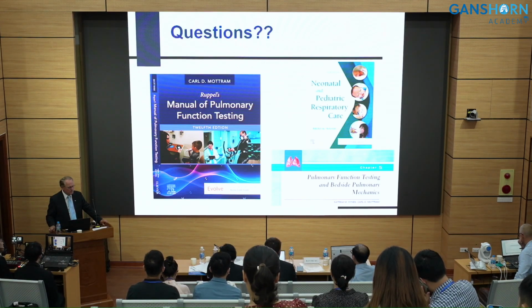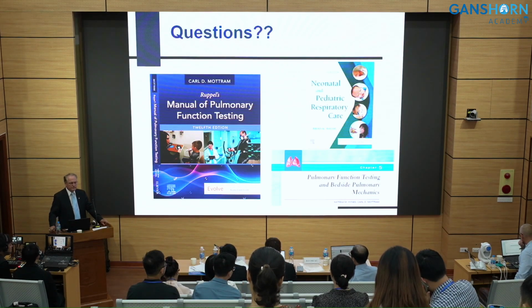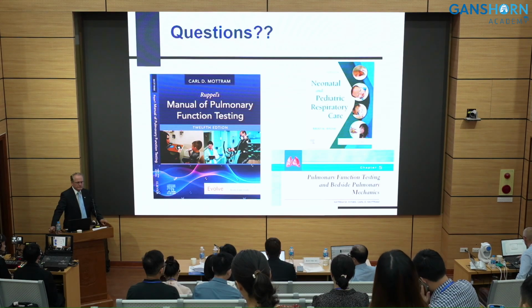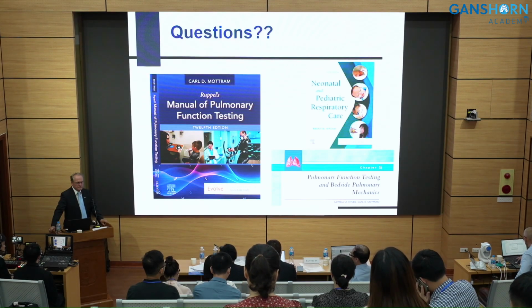Đối với trẻ em, tiêu chuẩn mới là R5 giảm 40% và X5 tăng 50%. Còn đối với người lớn thì R5 giảm 32% và X5 tăng 44%.